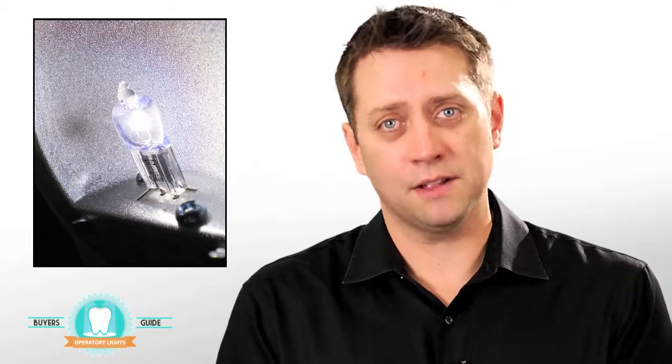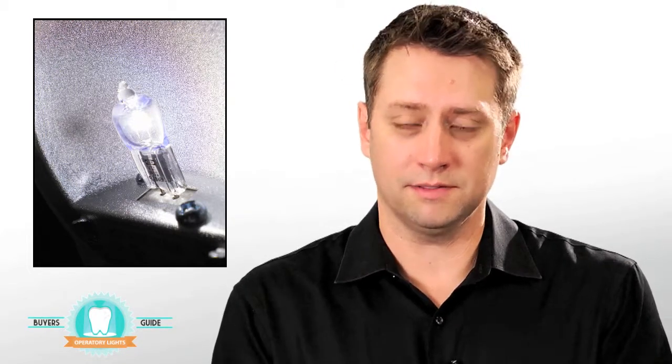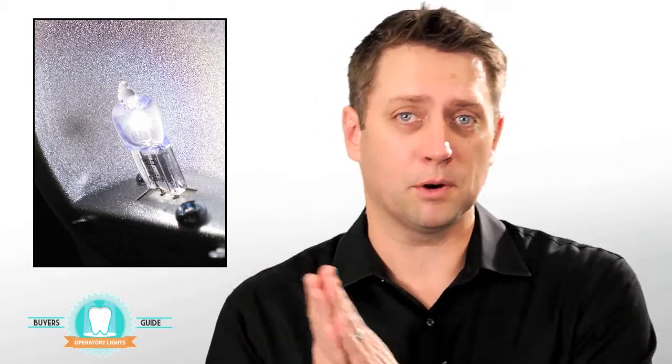Halogen bulbs aren't too much different, except they're smaller, they're in a quartz casing, and there's a halogen gas of some kind on the inside that helps prevent degradation of the tungsten filament, which means you could pump a lot more power through it, it's a lot brighter. We see halogen bulbs in our traditional operatory lights, we see halogen bulbs in our curing lights.